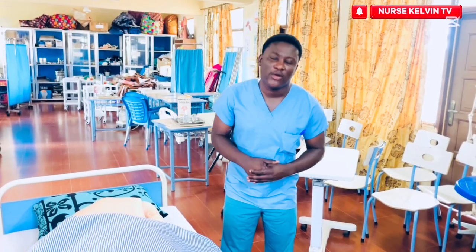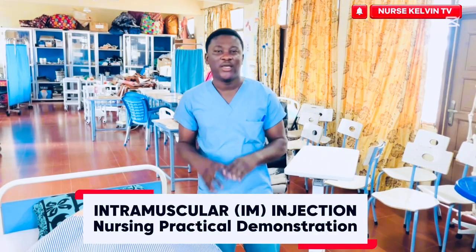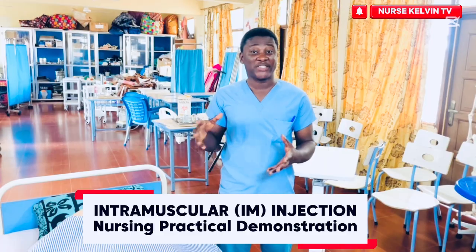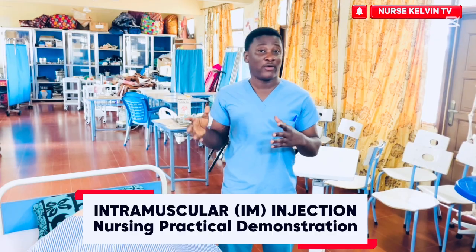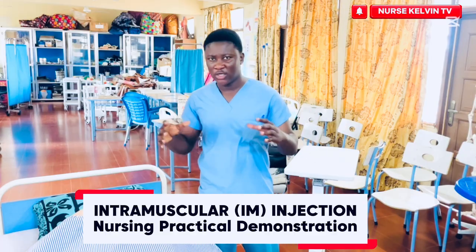On this episode, we're going to learn how to administer IM medication. It's one of the major procedures in nursing that most of us find a bit easy, but at the same time, if you don't do it well, you might make a mistake. So if you're writing your NMC or you have practical exams, let's learn together.